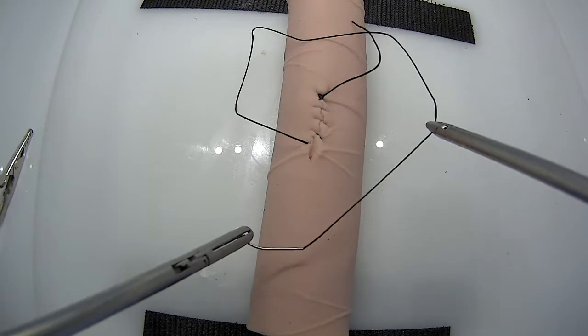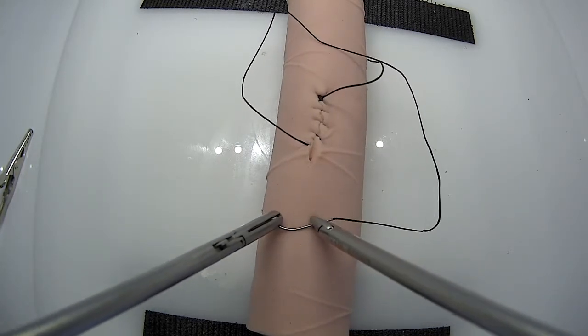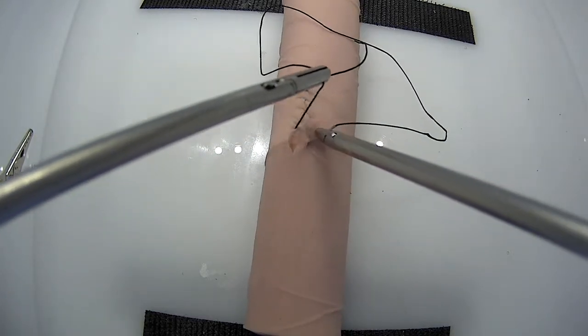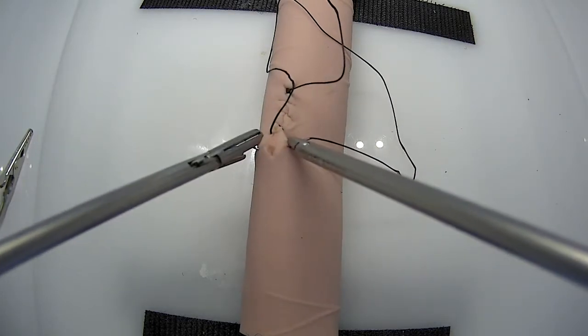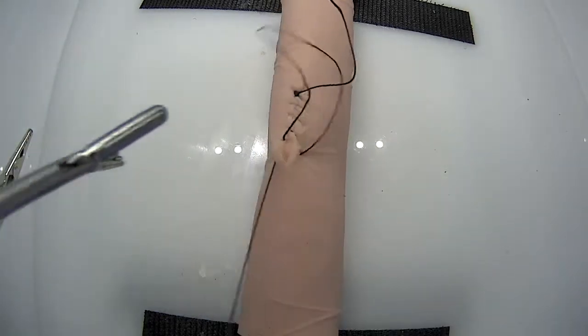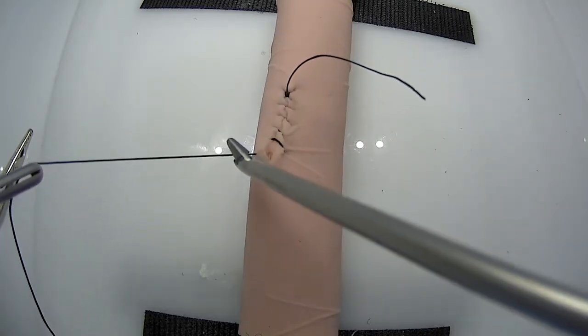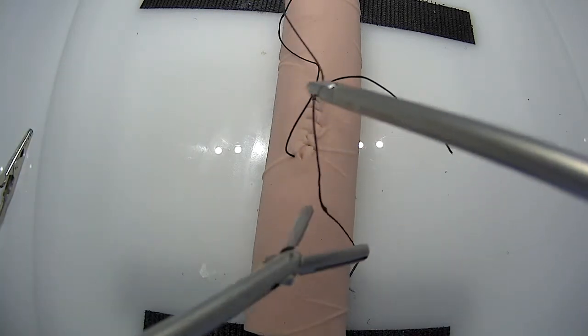When you work with a long suture, it's helpful to walk your way down the suture to reload it so that you can find it, especially if you don't have a wide field of view. So you walk yourself down to the end of the suture, cinch, and you walk yourself back to where the needle is.